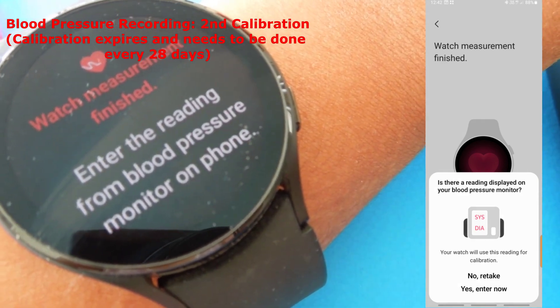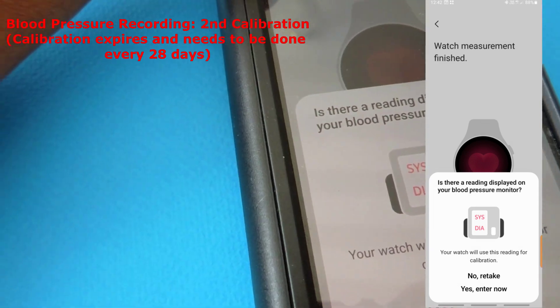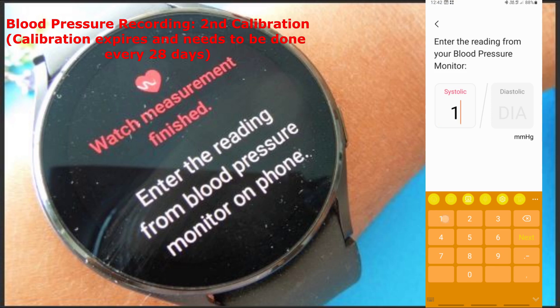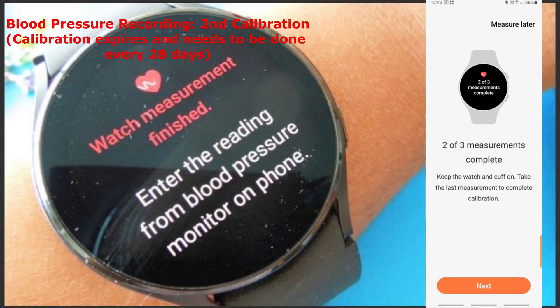The second reading is done. It says to enter the reading from the blood pressure monitor on the phone, so I enter my second reading. Now it says two of the three measurements have been completed — keep the watch and cuff on and take the last measurement.